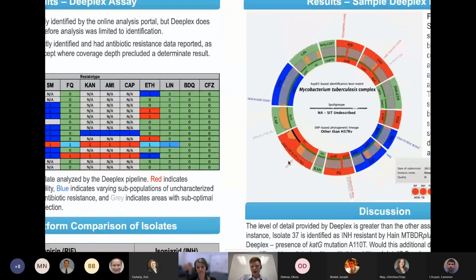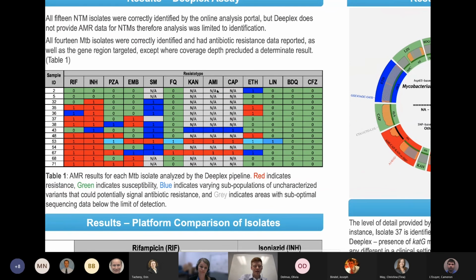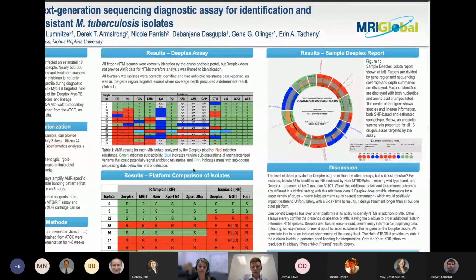So it's not necessarily a perfect assay right now. I think there are definite improvements that could be made. It's not like we saw this dropout on just one isolate, right? It's the large majority. For some reason, there's a dropout there, with only a few of them actually coming through with enough data to be able to recognize if something's resistant. So that's something we're interrogating more.